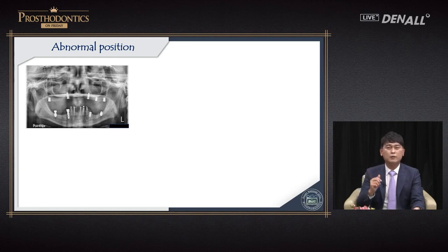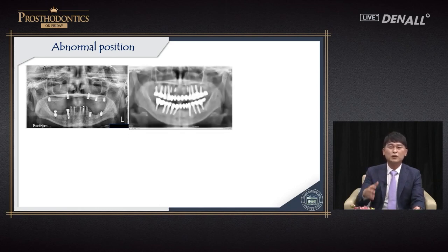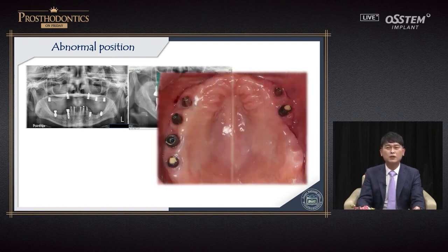This is not a patient. I get a lot of questions like this. My friend asks me how I do the prosthesis in this case. And implants are all destroyed here in many patients. Many implants were placed and part of them or most of them are destroyed and just a few remain. In this case, what do we need to do?